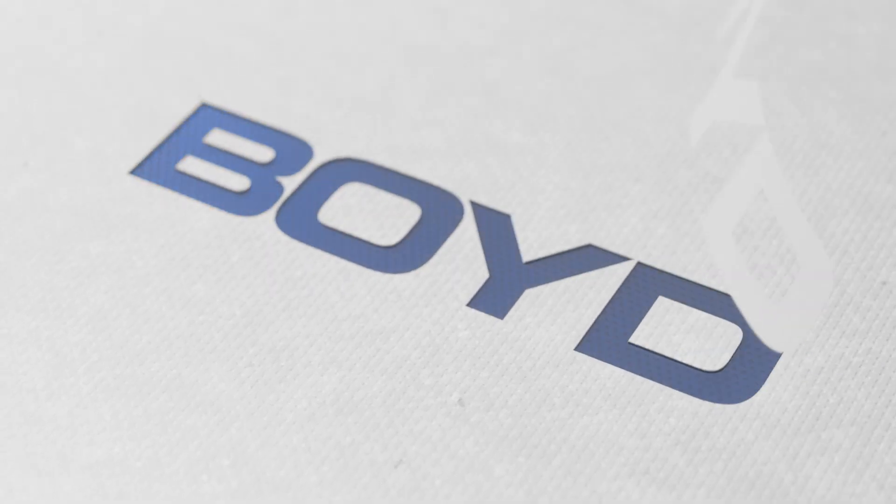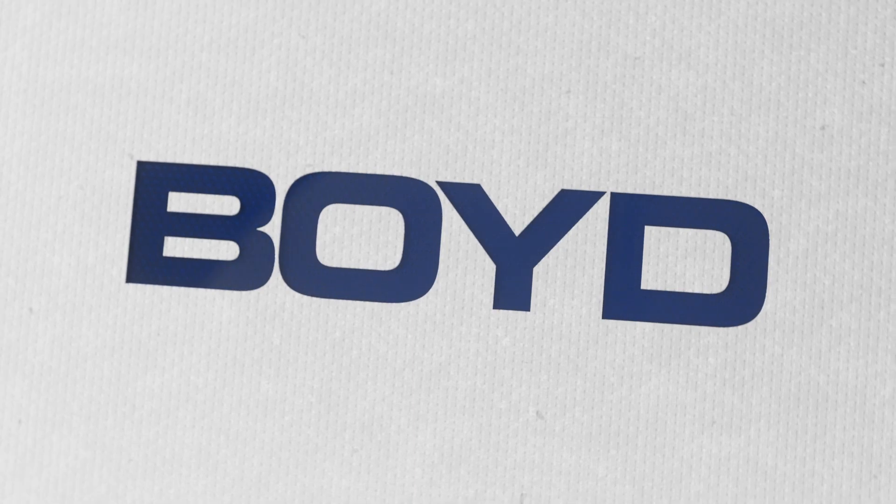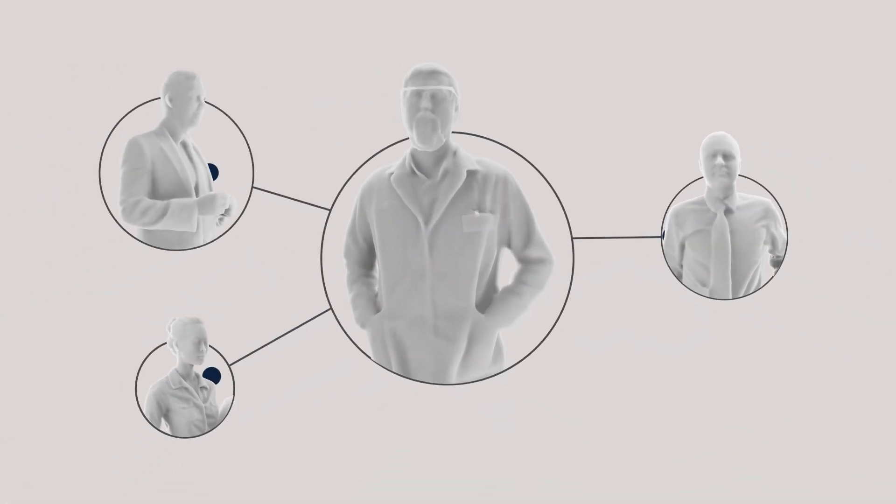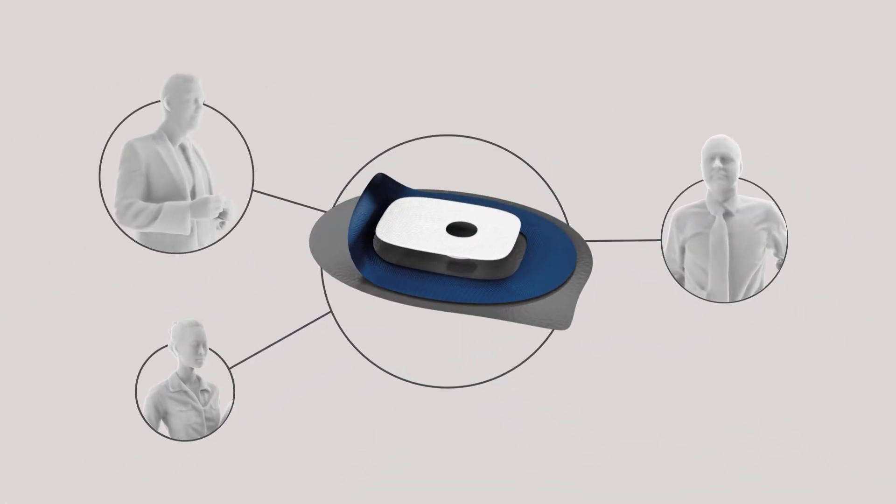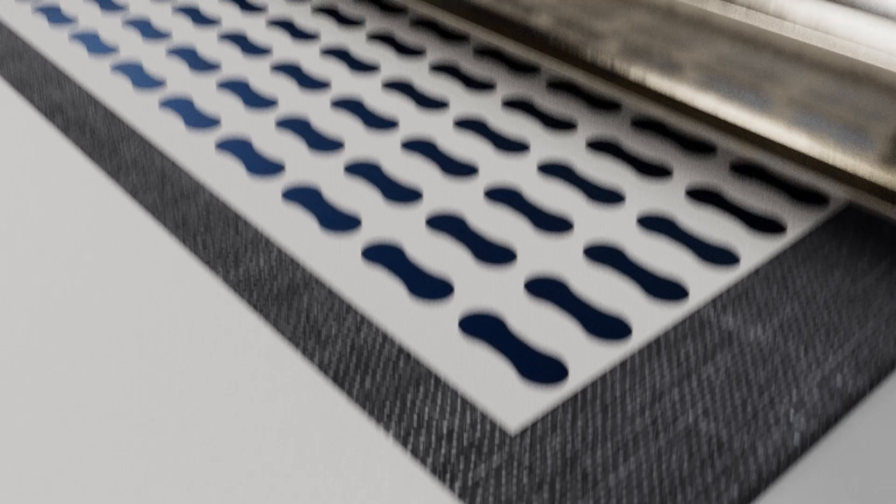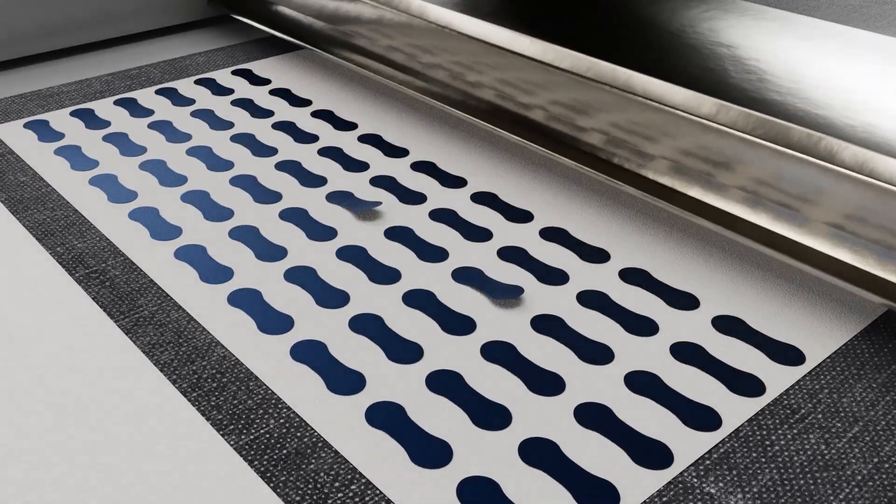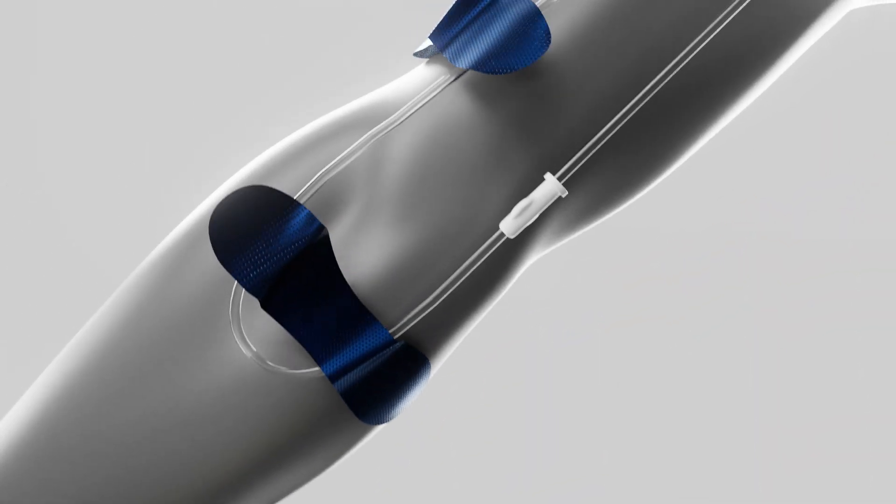At Boyd, our team collaborates with product engineers to bring designs to life by converting raw, flexible materials into usable parts and stick-to-skin wearable products.